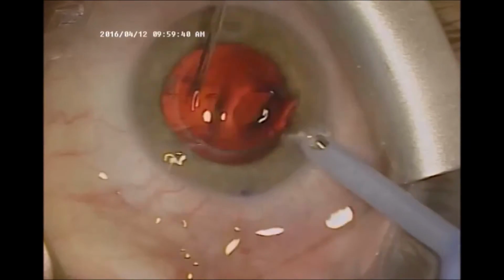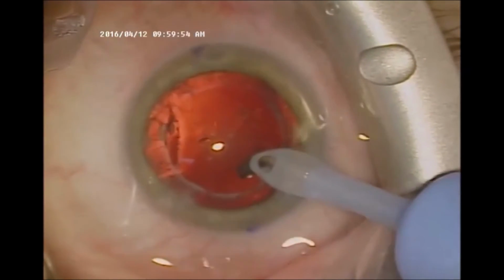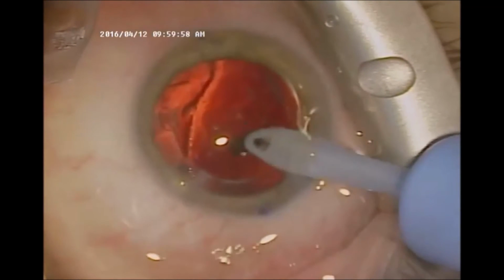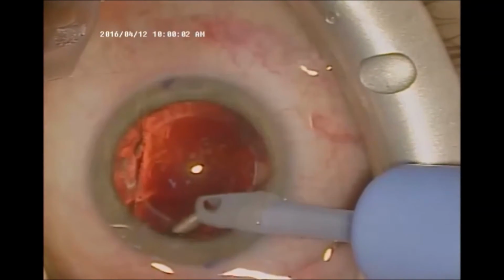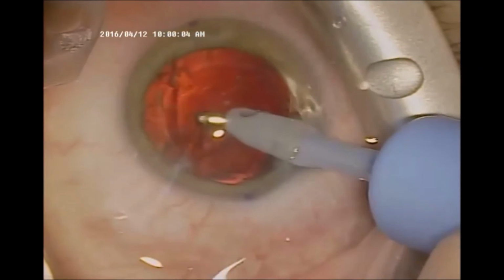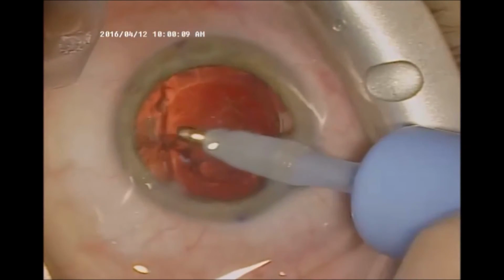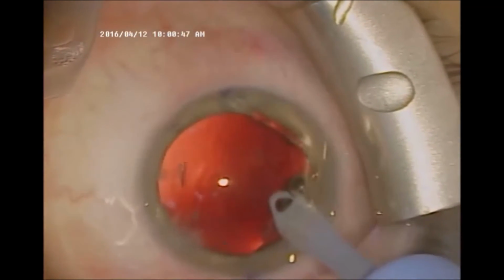Now that it's all been removed, jumping ahead, this is another segment called the irrigation aspiration, where I remove any lens materials which are still adhered or attached to the natural capsule. I typically start right underneath the wound and move around in a clockwise fashion, finishing over here.